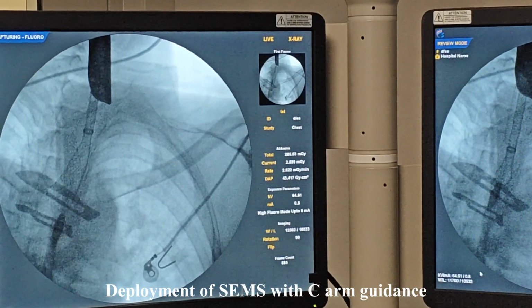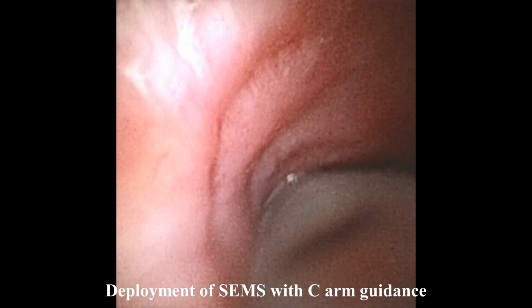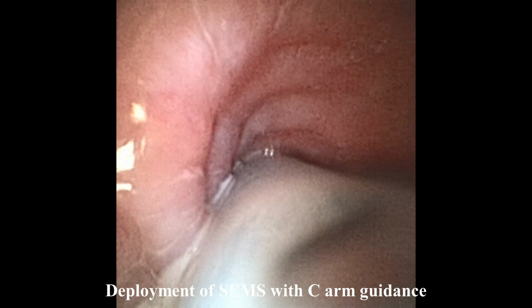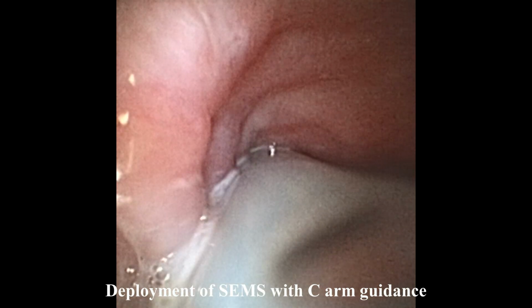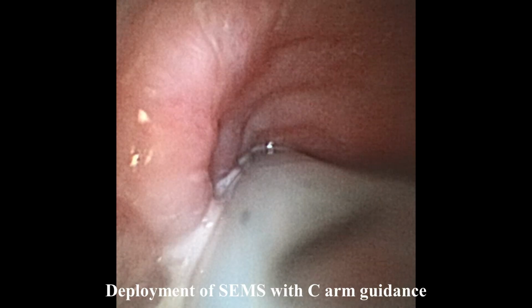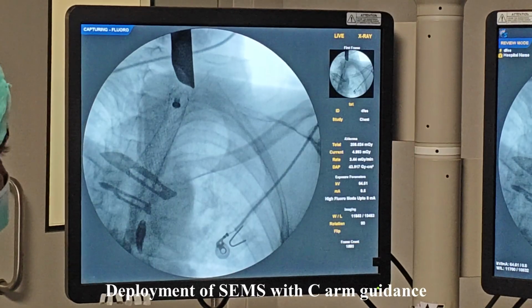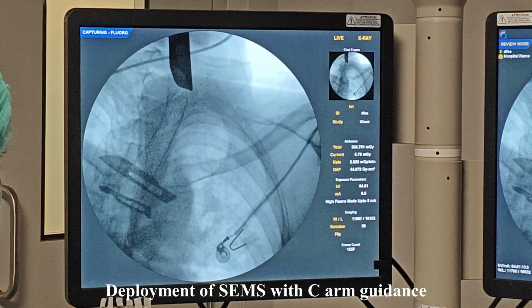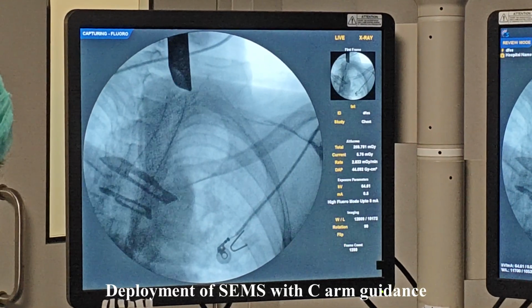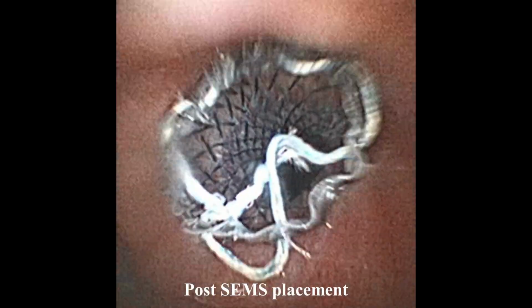And as you can see from the C-arm video here, the stent slowly starts opening up. And this is again reconfirmed with the help of a direct bronchoscopic visualization. Generally, we use these single-use scopes so that our routine scopes don't get damaged. And you can see that the stent is gradually opening up and the stent is getting deployed with the help of the bronchoscopic visualization and the C-arm guidance here. And now the stent is completely placed and it has opened up inside the trachea.